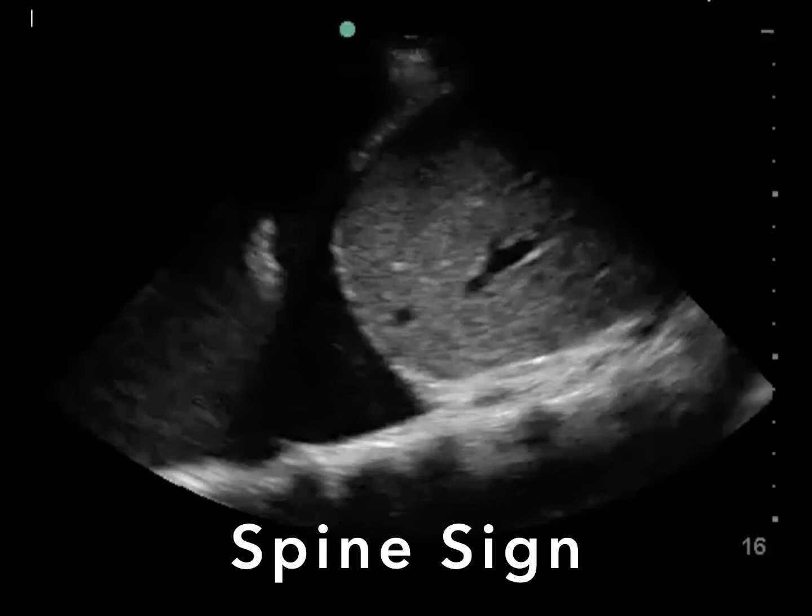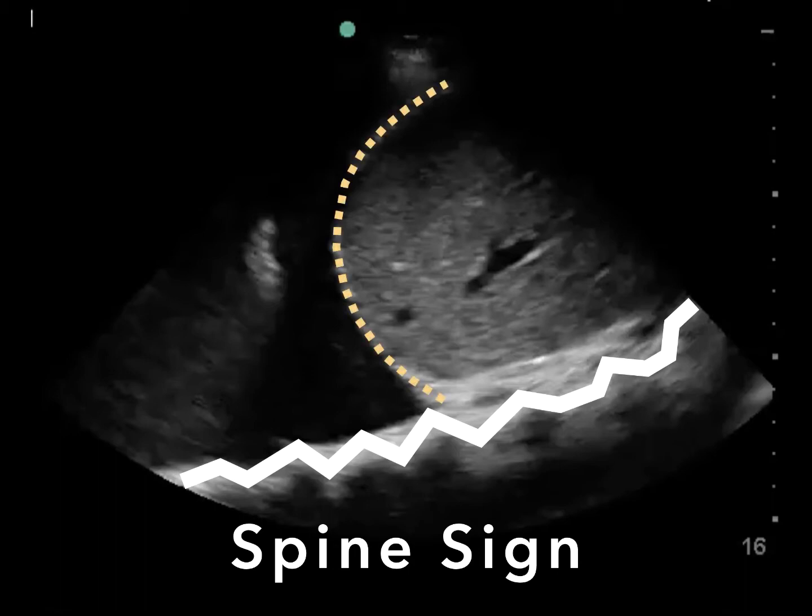The last sonographic finding to be familiar with is pleural effusion. Here we see a finding called the spine sign. Deep in the image we see the bright white echoes of the transverse processes of the spine that I've highlighted in white. I've delineated the diaphragm in orange. The important point to note here is that the spine sign extends above the diaphragm.